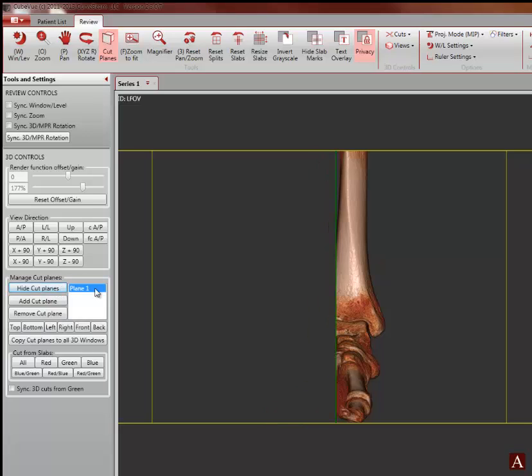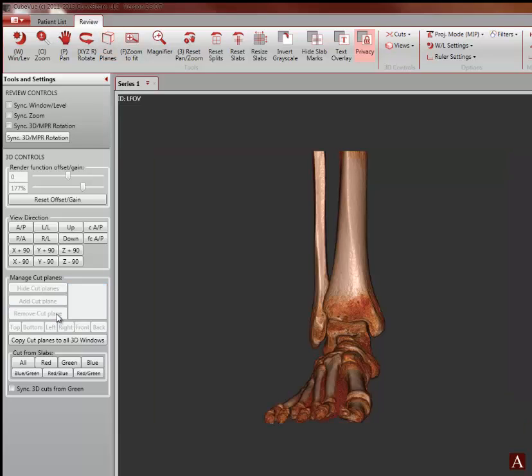To remove the cut plane permanently, click on the remove cut plane and the entire 3D rendering will be restored.